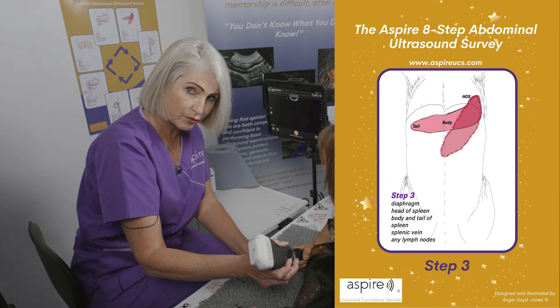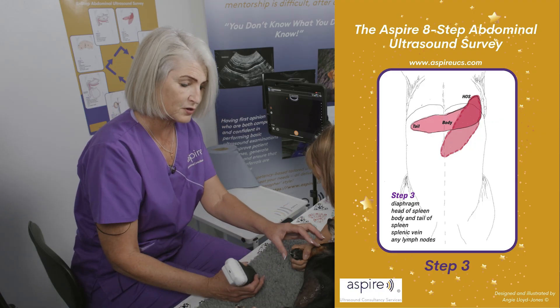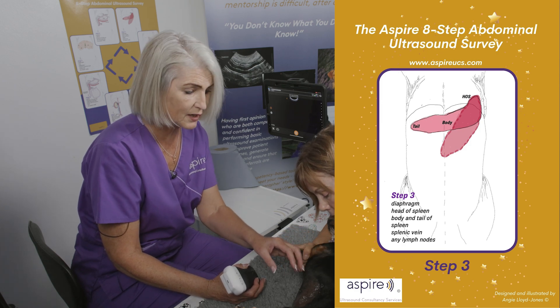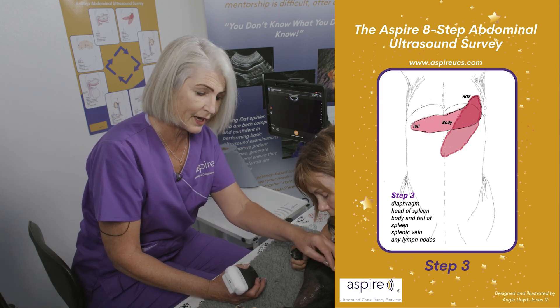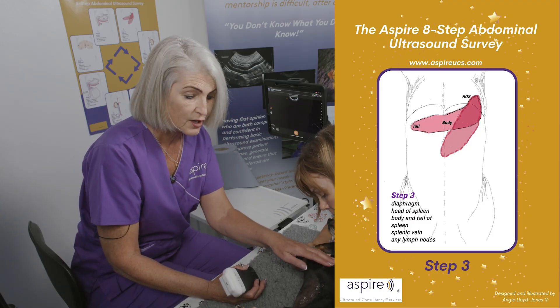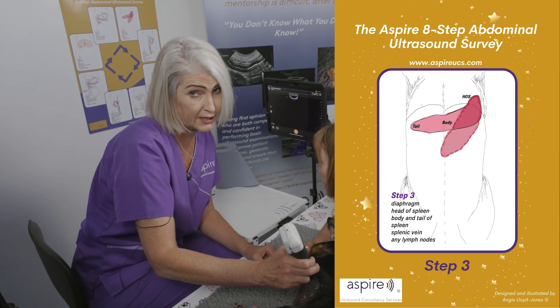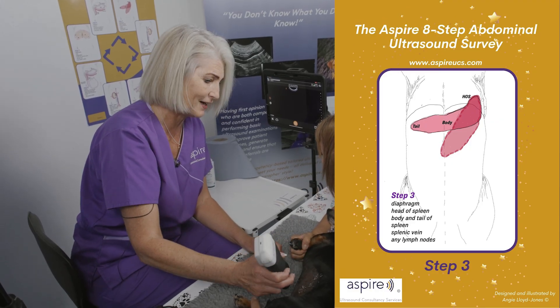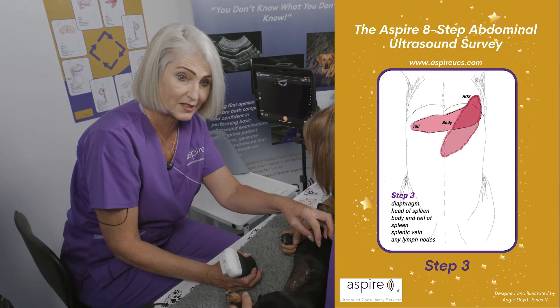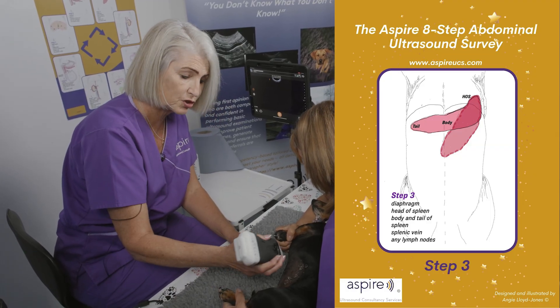It's also important when scanning the spleen to make sure that we cover the head of the spleen. Spleens vary in their position in dogs in particular, but you'll always find the head of the spleen tucked right up under the costal margin. Don't just scan up to the border of the costal margin — I did that for the first few months of scanning and didn't realize the head of the spleen was under there. You need to angle right up under, which we'll show you.